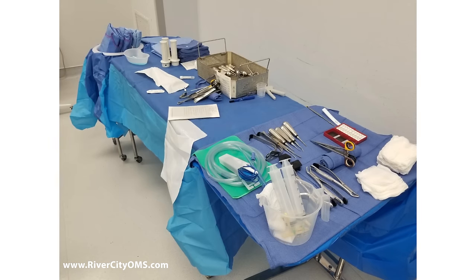Okay, so now here's our back table back here. This is the Mayo tray that we already looked at, and you can see it's got, let me see if I can pull it up again. You can see it's got little feet down here, and that's the stand itself, and that slides under the bed so that the instruments are over the patient. And then, like I said, this is the back table right here.